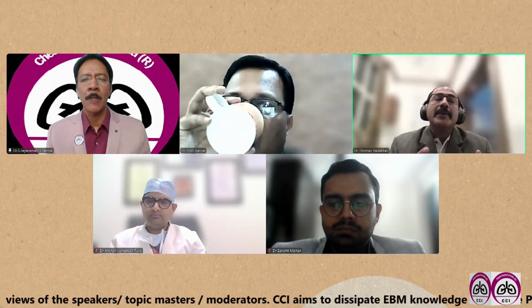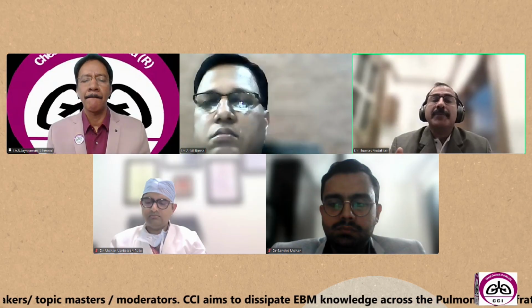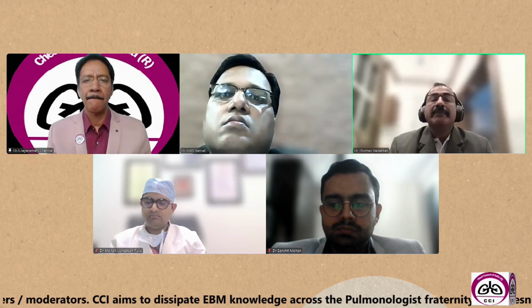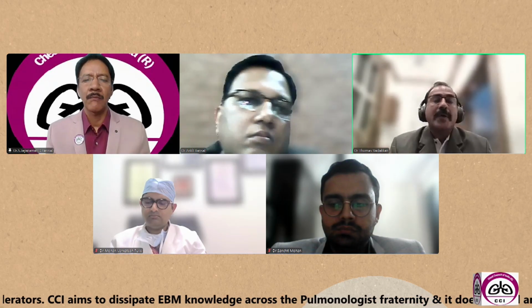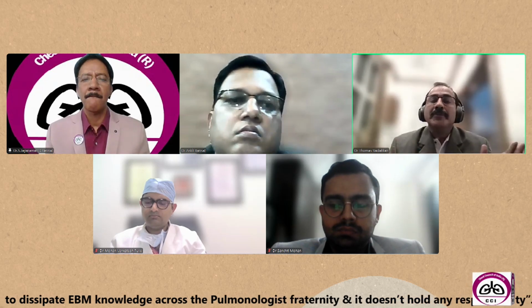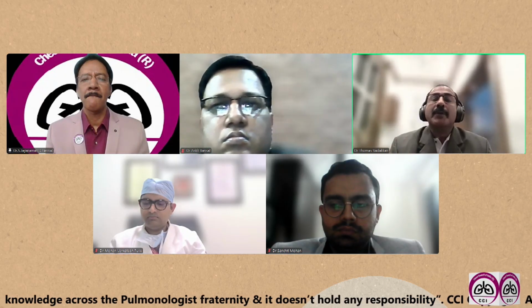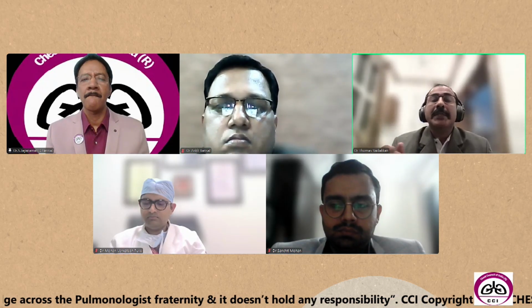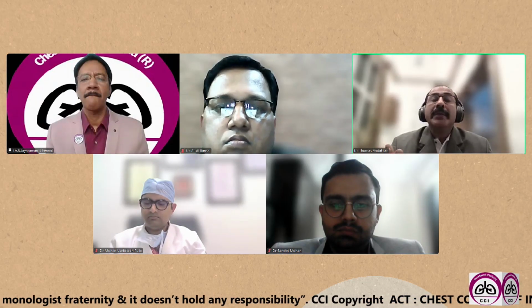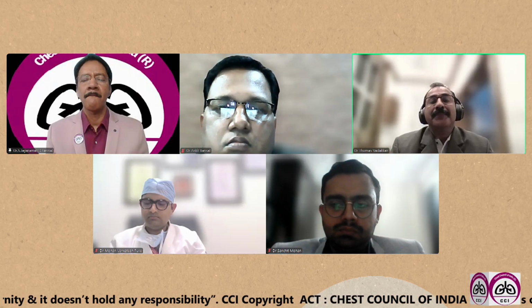It's also important in scenarios where there's necrotic tissue inside. When you use cryo, you can get a bulk of tissue so that you will not miss the diagnosis. False negativity can be avoided. So I think this is a bridge between the true mediastinoscopy and the conventional FNA. Either you can use the intranodal forceps or cryo, so that your yield will be better and you'll get sufficient tissue in cases where lymphoma or granulomatous disease is a concern.